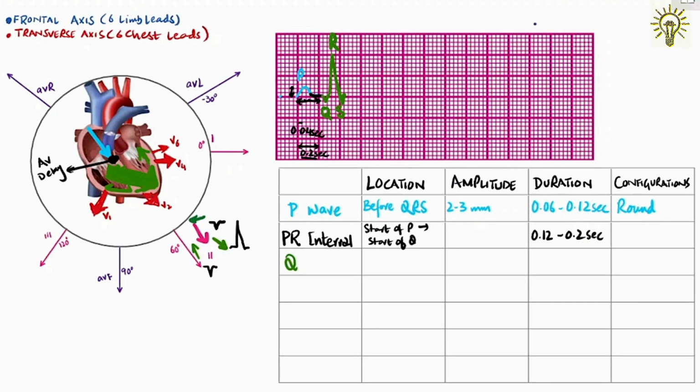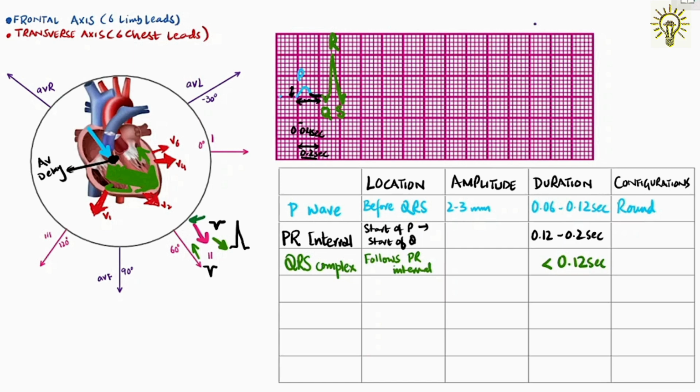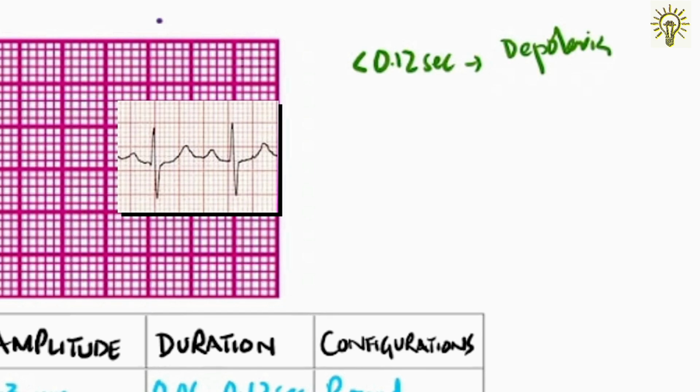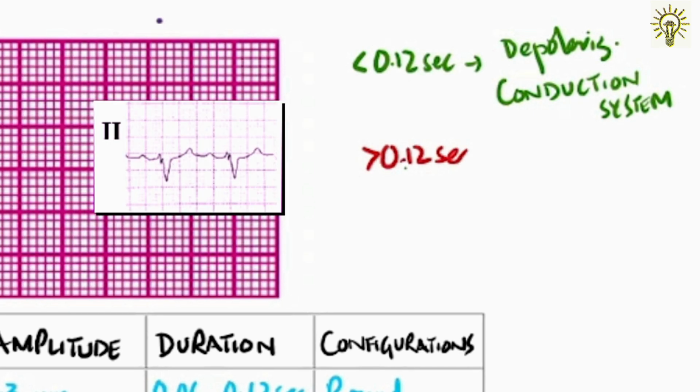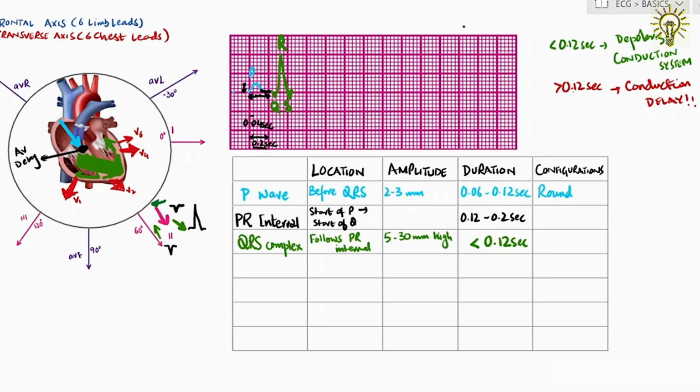Coming up next is the QRS complex, which is a very important segment signifying the ventricular depolarization. Let's get into knowing the QRS complex better. The duration of the QRS complex is less than 0.12 seconds. A short QRS means depolarization has undergone the usual normal bundle branch and Purkinje fiber system for quick depolarization, hence the shortened time. A prolonged duration or broad QRS signifies conduction anomaly, meaning the origin of depolarization may not have followed the usual path of depolarization. This means ectopic sites of origin and slower ventricular muscle conduction without a dedicated fast conduction pathway.